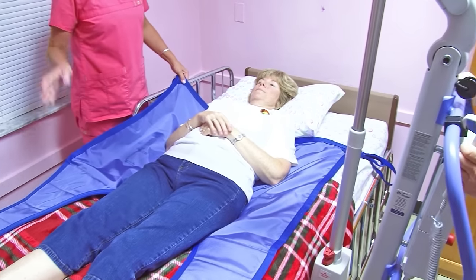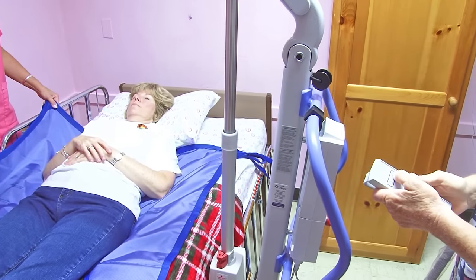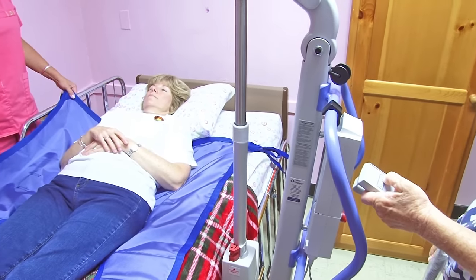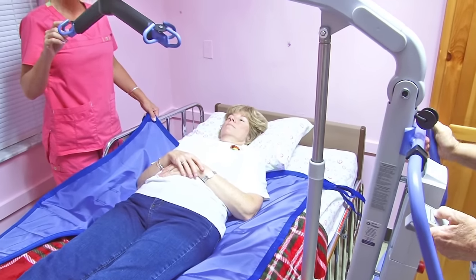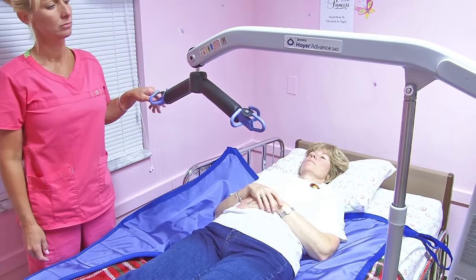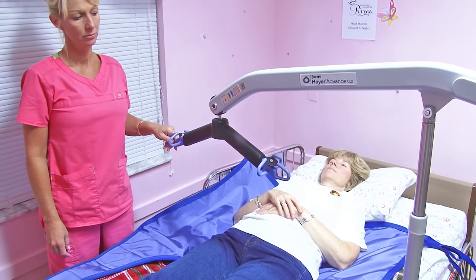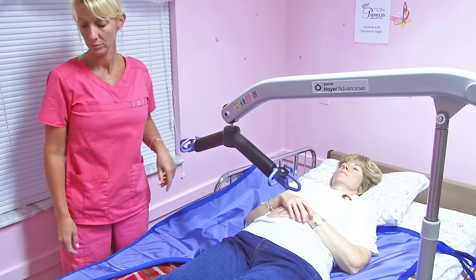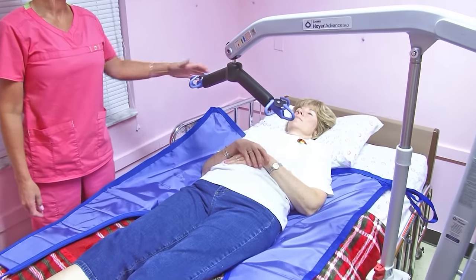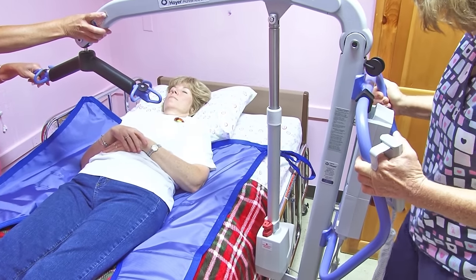We'll lower the Hoyer Lift — just press the arrow that says lower. It's going to be fairly low because we have to be able to put the hooks onto there. You may have to reposition the Hoyer so that you can get a little bit closer. And, of course, relock.